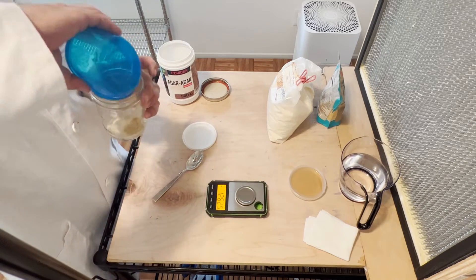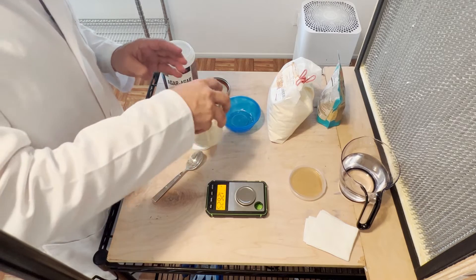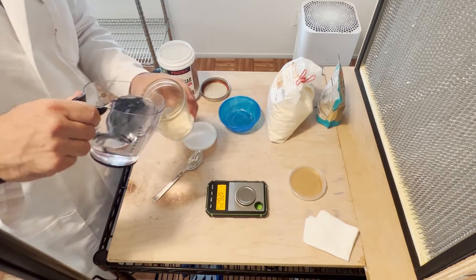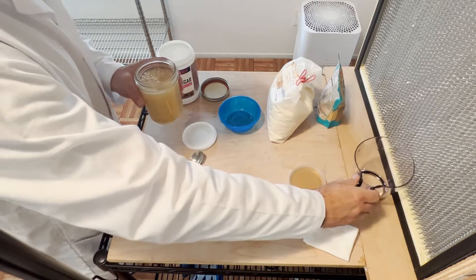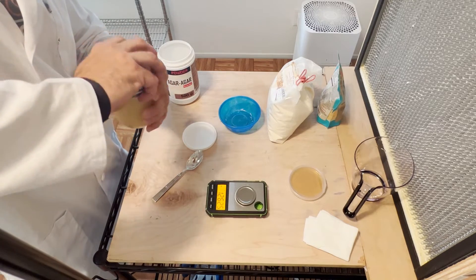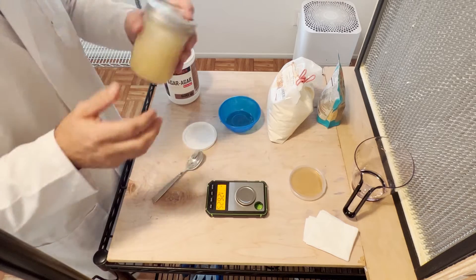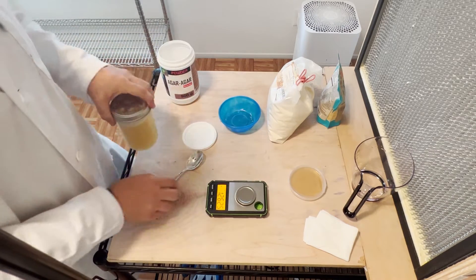I'm going to put this in my jar, mix it up just a little bit, then add my cup and a half of water. Put my lid on top and shake up the contents so they go all through the water, and then I'm going to put this in my pressure cooker.